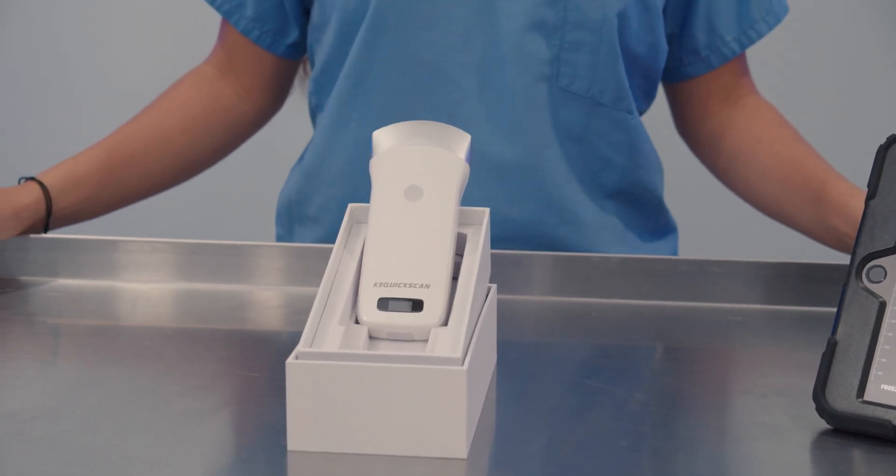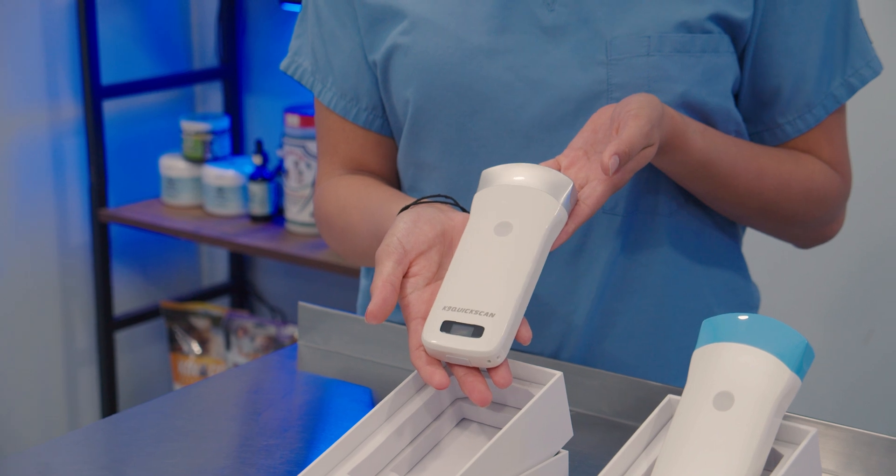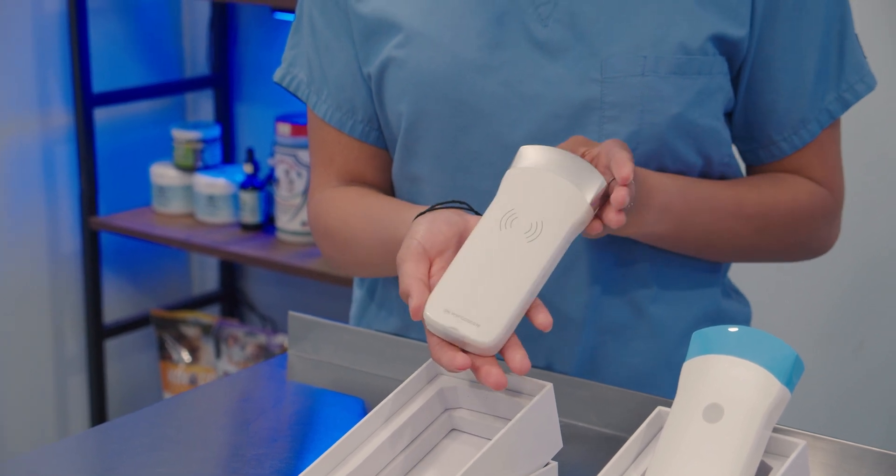The Q3 probe comes with 80 elements, which will be the smallest in the lineup. The battery has a 3 hour run time and includes a 1 year warranty.